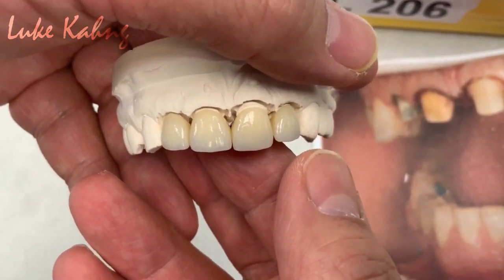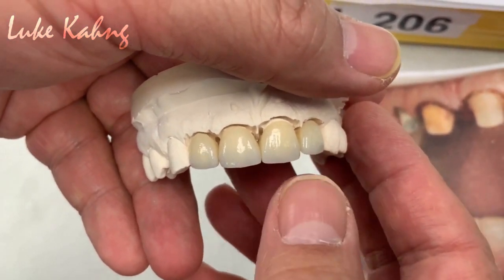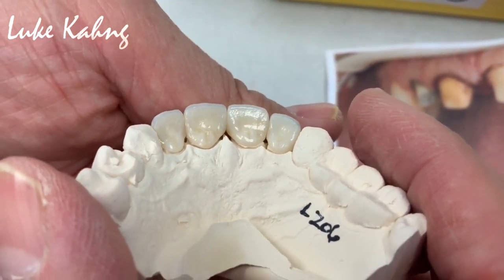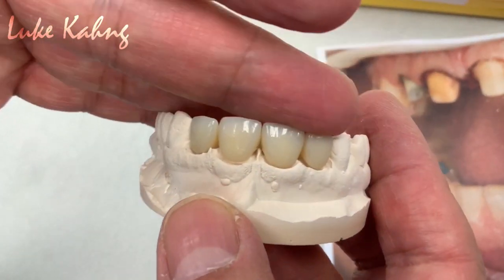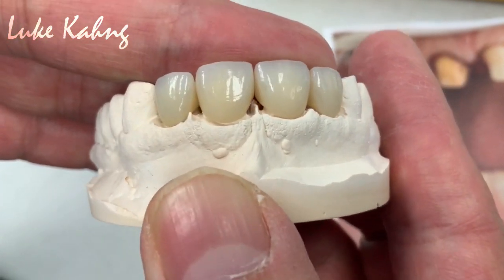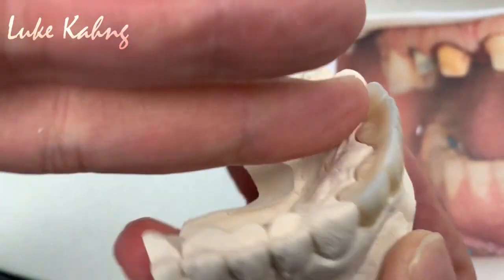Beautiful aesthetic case is done with good textures. Okay, size of the tooth, contour. Of course, lingual contour is more, it's really good. This is the final illustrations. Right, sent to New York.